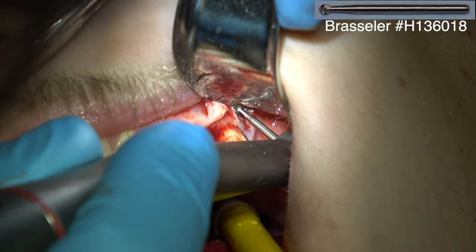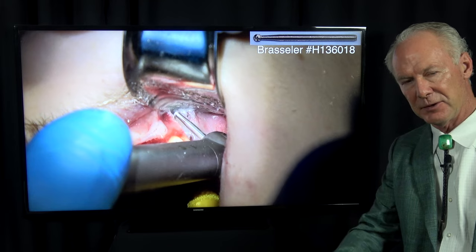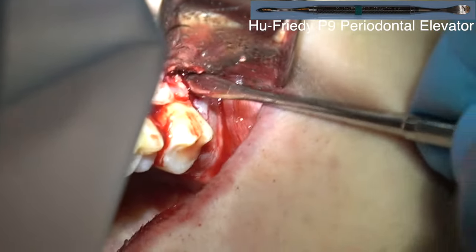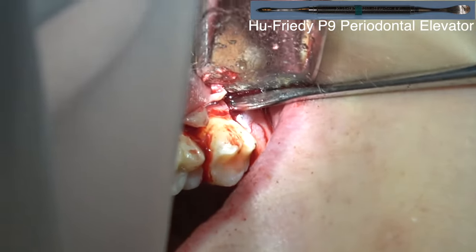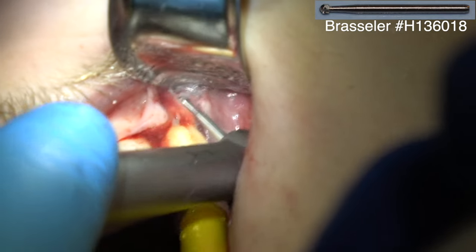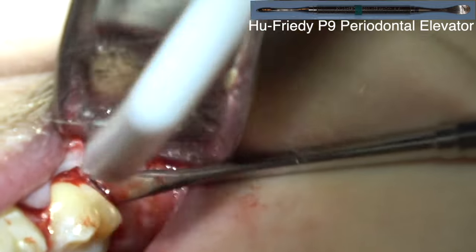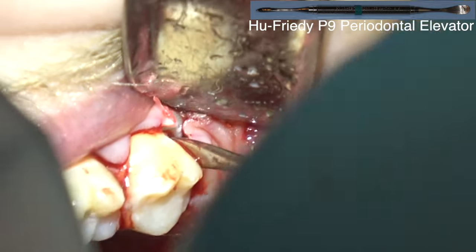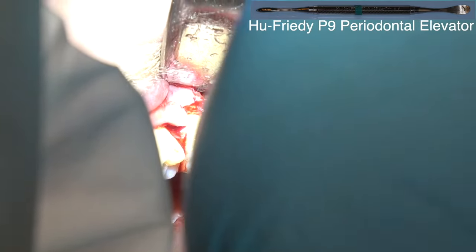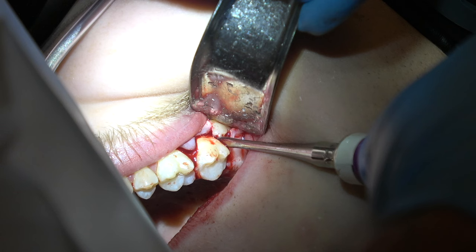With this long shank round bur I'm actually cutting into the third molar because I'm going to lose that tooth anyway — just trying to gain a purchase point at about the CEJ so I've got a place to elevate it. If you're right at the top of the tooth at the occlusal line that's probably not enough of a purchase point to elevate one that's plastered to the tooth in front with fully formed roots. These were just unusually difficult maxillary impacted wisdom teeth. Now I'm trying to place the 301 and elevate it and it's just not budging, so you've got to have a little space distal to the tooth.